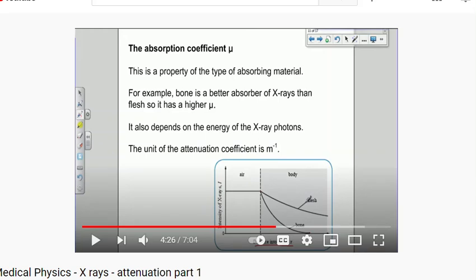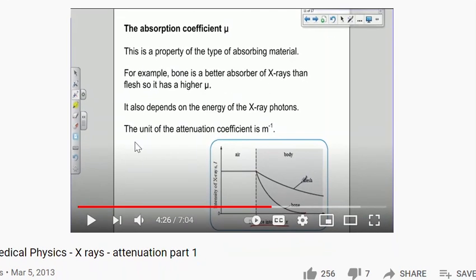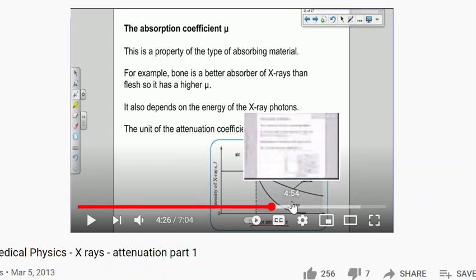So this video is pretty technical, but what it boils down to is this: as the X-ray beam enters the patient's body, first off, we have a tendency to think that X-rays get filtered out by the air, and that's just not true, and it's not a practical way to be thinking about X-rays. Air doesn't really filter out any X-rays, but anything that it passes through that has a semi-solid medium to it does. So soft tissue absorbs a lot of X-rays. Bone absorbs exponentially more X-rays.